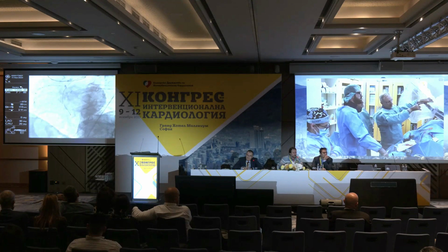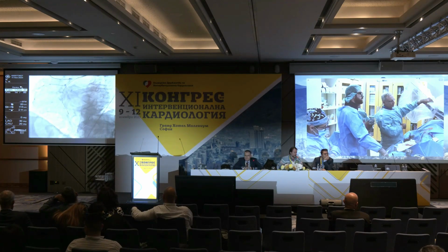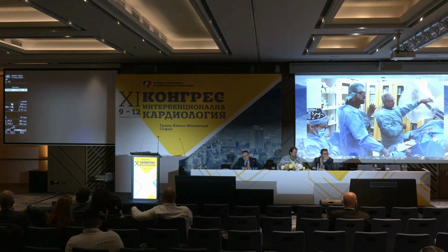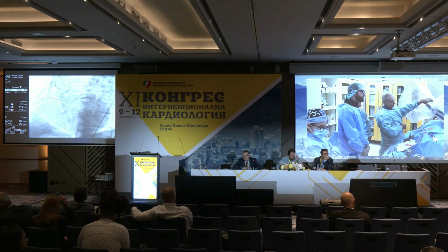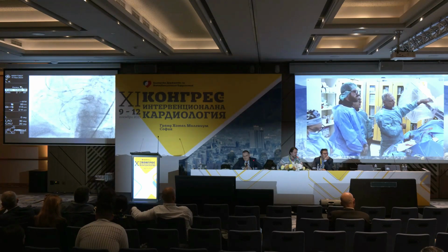Yeah, but you see, yeah, exactly. You're saying the right thing. You see the contrast staying on top of it. Yes, and it came as a hematoma or something was pushed. It is probably the hematoma that we see in this direction and dissected a vessel or maybe created some space. I think this is related to the initial Confianza Pro pathway.